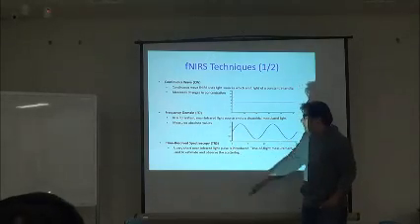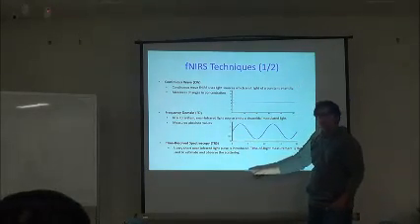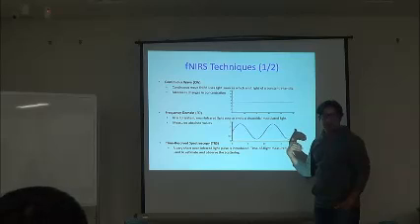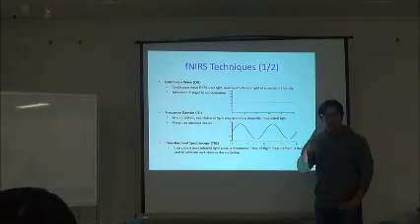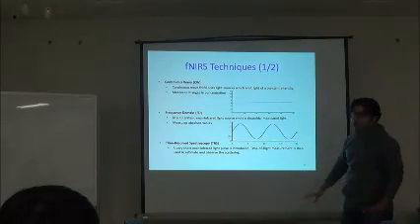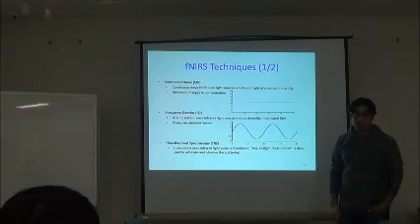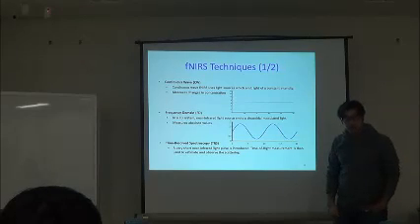And in case of the time resolved, what we do is we just give a short pulse, a very short pulse in the range of picoseconds, and we try to detect the number of photons arriving at the detector, and using the concept of the time of flight, we estimate the total distance the photons have traveled, and then we can find out the changes. So in case of continuous wave, we can find out the changes in the concentration of hemoglobins. In case of frequency domain, we can even measure the absolute values.